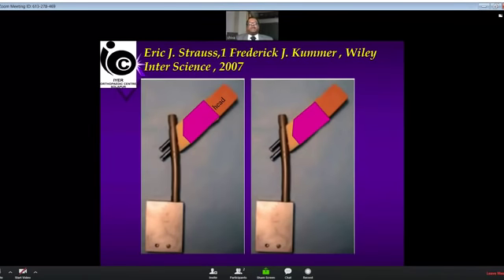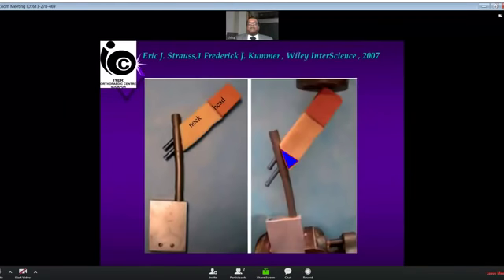What he says is, in an intertrochanteric fracture, when the hip is loaded, gradually the fracture collapses and the gap at the intertrochanteric fracture becomes less and less. If there is a medial comminution as marked here with the blue triangle, when the hip is loaded from the top, the neck collapses less on the superior part and more on the inferior part. This differential collapse because of the gap causes the inferior screw to walk out more outside.